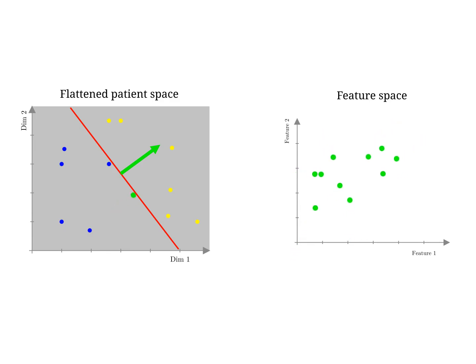We can then simulate the corresponding evolution of cells in the feature space and study how their properties are affected. In the case of Alzheimer's data, it allowed us to observe that the cells in patients affected with the disease on average became smaller, more dense, and with a stronger fluctuation in the cell density. This simple distinction between control group and the Alzheimer's patients could have been much harder to spot amidst the vast amount of data in the original segmented images.